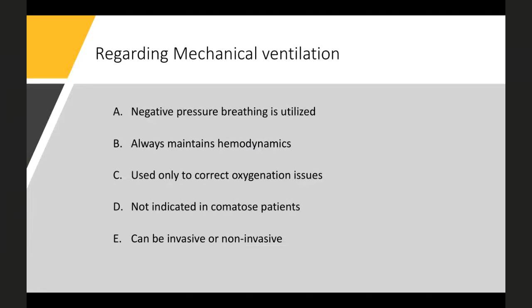Actually, deliberately we didn't discuss non-invasive ventilation, or we didn't stress it. Non-invasive ventilation is definitely there. Whether to go for an invasive device or not is a different decision. Negative pressure breathing, nowadays we don't do that. Always maintaining hemodynamics is difficult because there will be hemodynamic repercussions when we switch from negative pressure breathing to positive pressure breathing. It is used not only to correct oxygenation issues, but ventilation issues, and even airway protection and maintaining the respiration process also come into play.